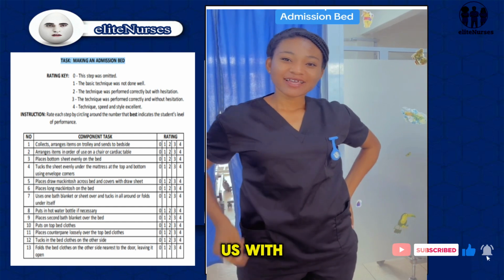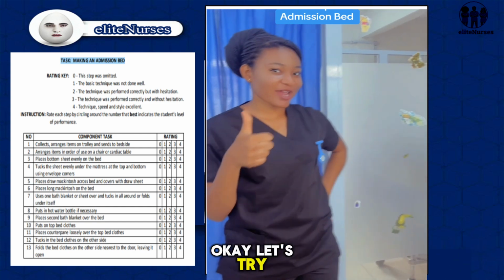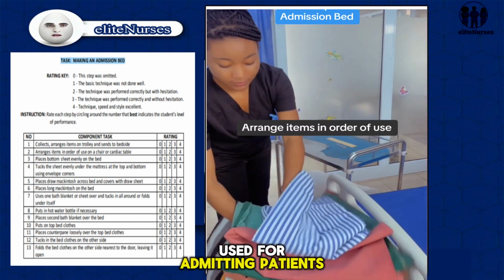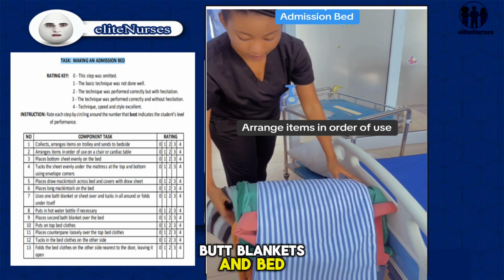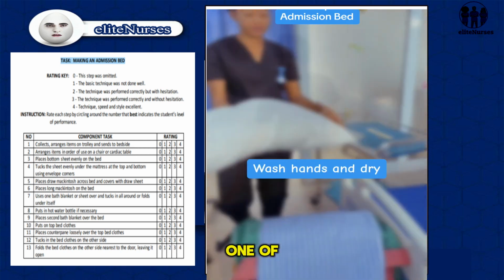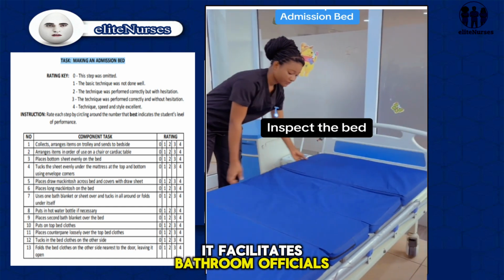Please, can you assist us with the procedure in making an admission bed? Okay, let's try. An admission bed is a special bed used for admitting patients. Bath blankets and bed accessories are some of the special requirements needed. One of the purposes of making an admission bed is that it facilitates bathing of patients in bed.